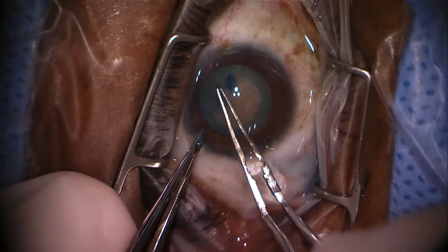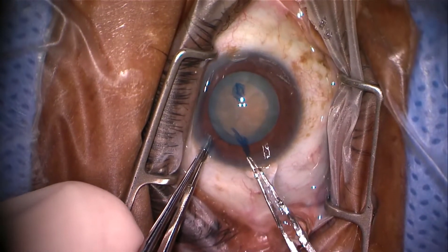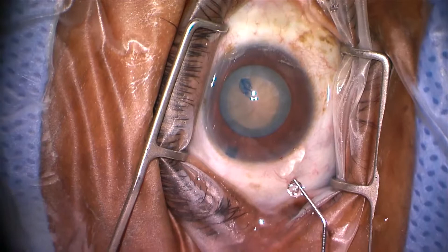We just move that little capsular fragment that was amputated out of the way so we could see, and then we'll turn it all the way around here and see it nicely separate. And that's pretty much how a good example of the TriPan Blue capsular staining can be done.